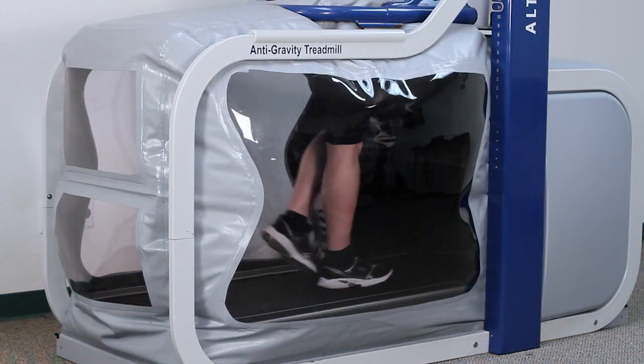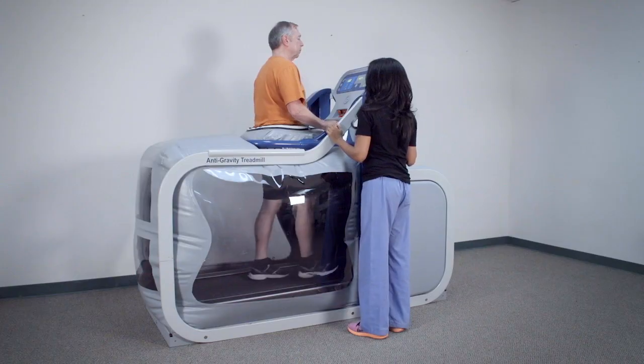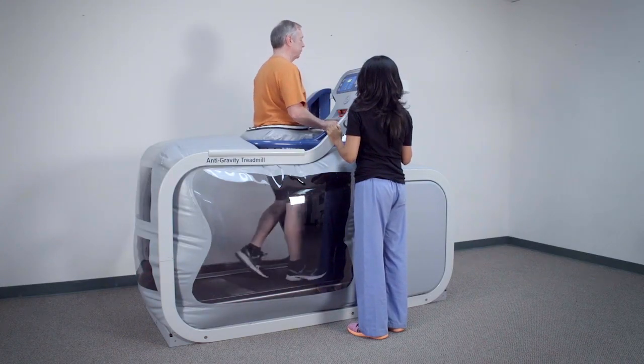The AlterG allows for longer treatment sessions since patients have a higher tolerance versus other methods of body weight-supported therapy. Longer treatment means more practice, which leads to improved ambulation.